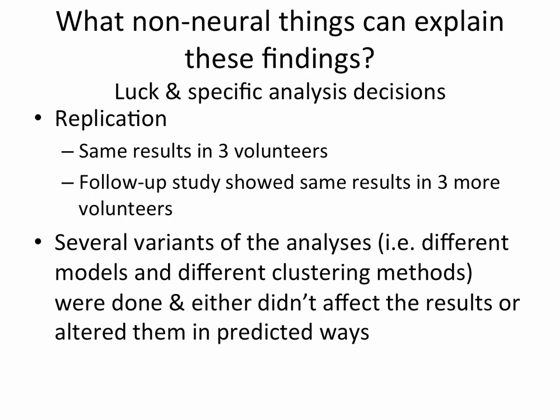So it's 20-second stimulus and 40 seconds rest. And there was a 2-second TR, so we have 30 time points. So we were looking for any shape of those 30 time points that was repeated 100 times in a significant way. So the most robust analysis was the one that wasn't making any assumption about the shape at all.